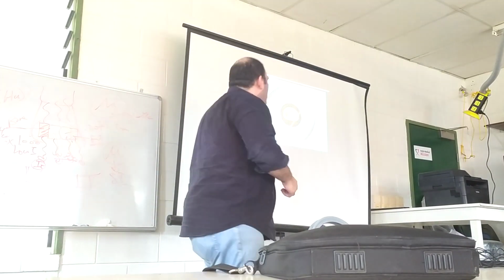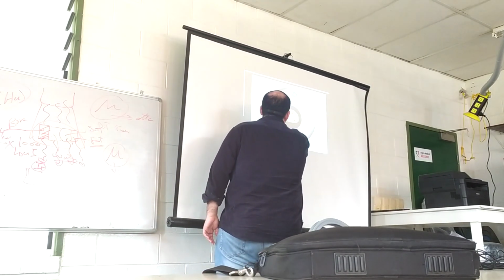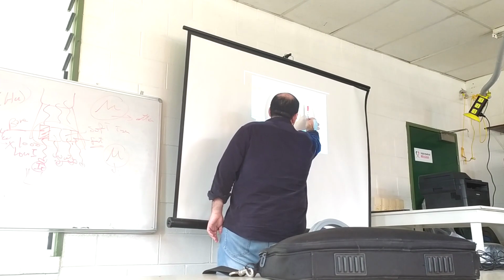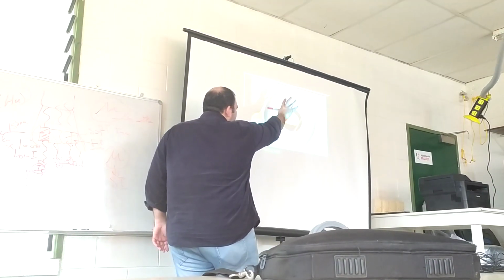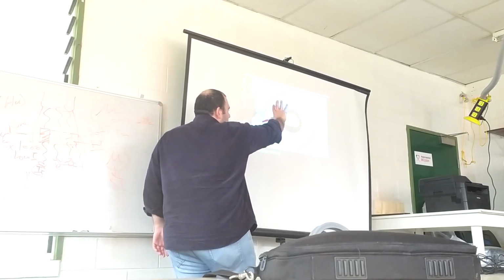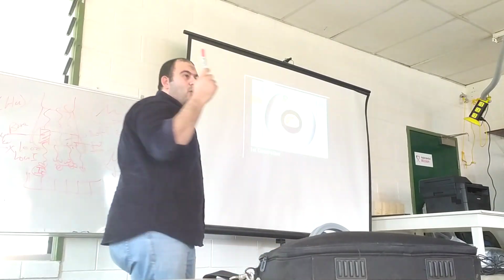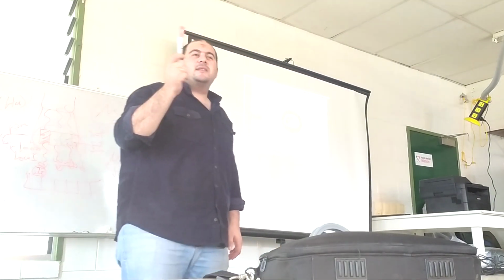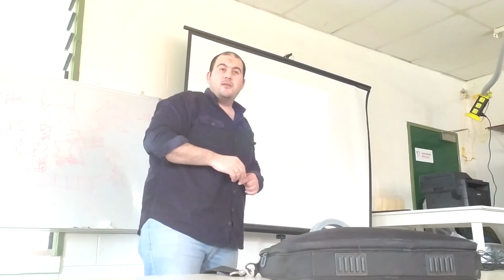One detector. So you wanted to cover this slice. You have to move from here to this position. After that, you will angulate or change the angle to get another projection or another view, till you reach 180 degrees to cover one slice. This is the first generation of CT.